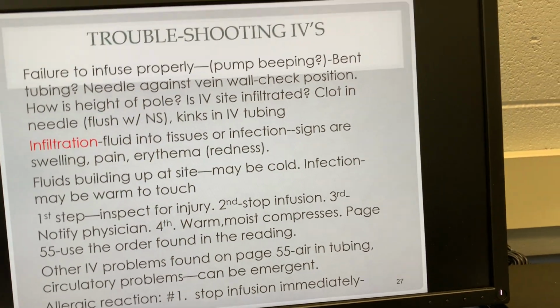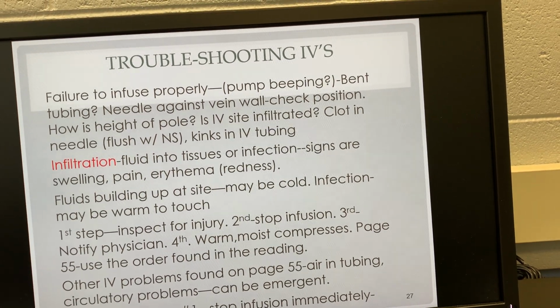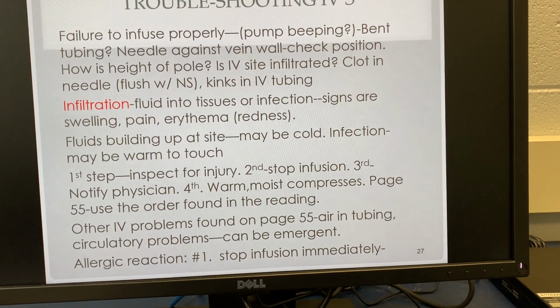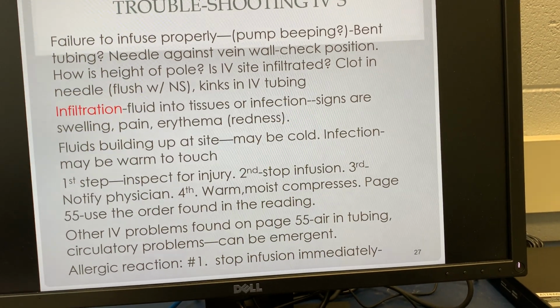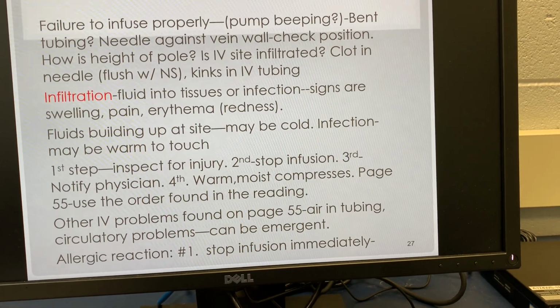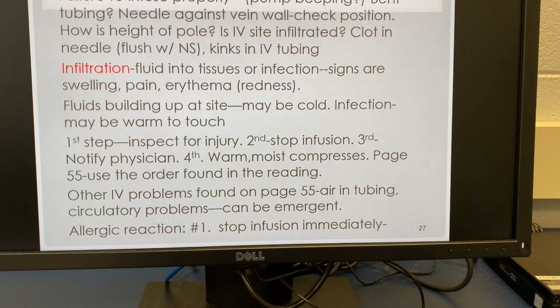So you're inspecting, you're looking, you're seeing, do I have swelling? Do I have pain? Do I have redness? That indicates a problem. Is it cold to the touch or warm to the touch? Then, after you've looked at it, then you stop the infusion. You don't have to DC the IV, just stop the fluid from going in. You're just throwing good medicine after bad.